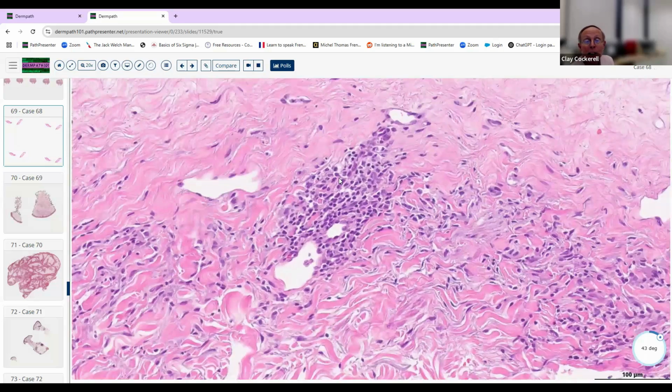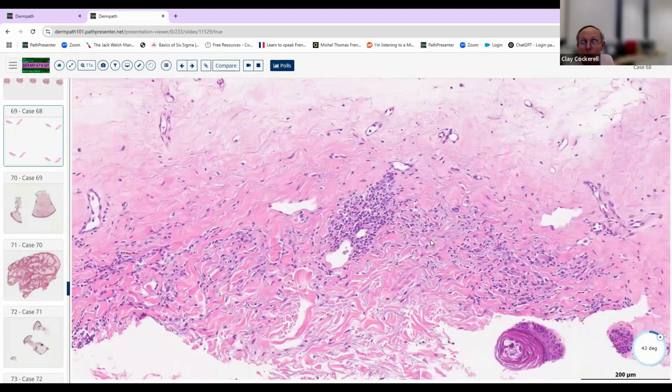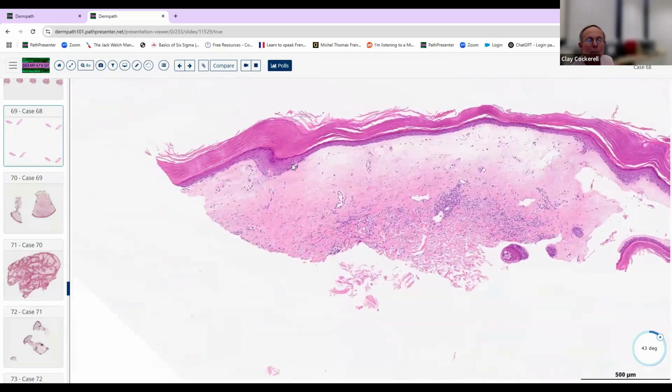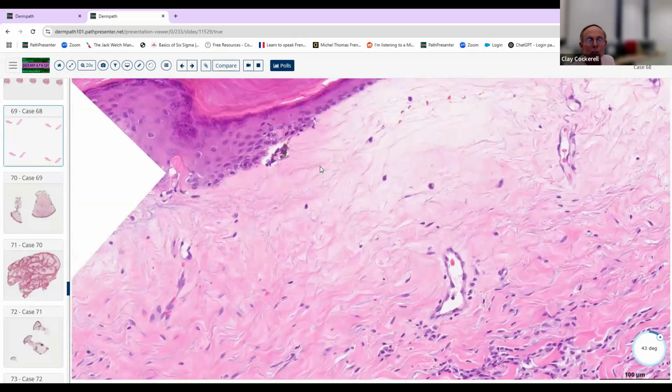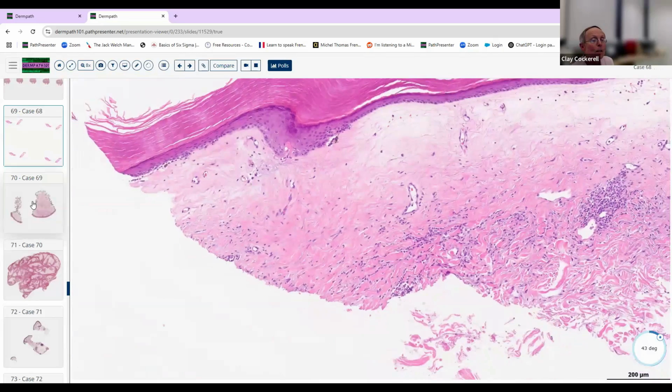Plasma cells in the infiltrate. If they put syphilis as a choice, please don't choose it. This is not chronic graft versus host disease. There's no sclerotic irregular collagen with the bizarre fibroblasts here. This has got edema, which you usually don't see in chronic radiation dermatitis. I'm probably not going to show you that to distinguish among those two, but nevertheless, this is a good example of lichen sclerosus that hopefully you all were able to pick up pretty easily.